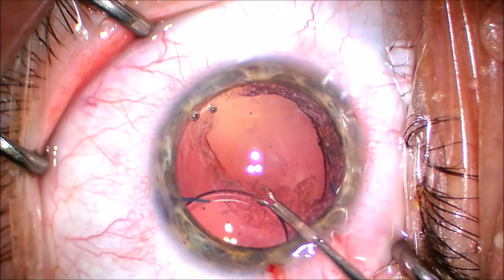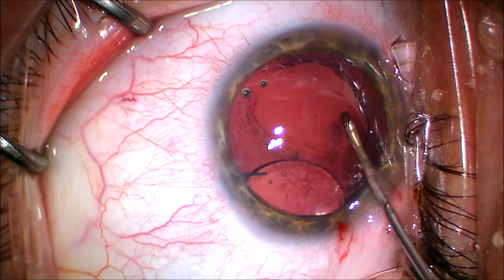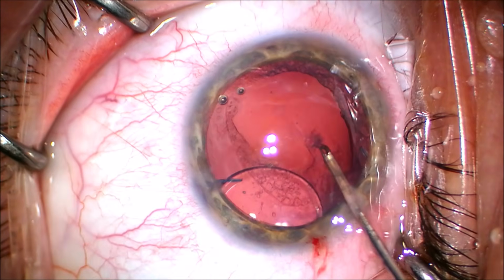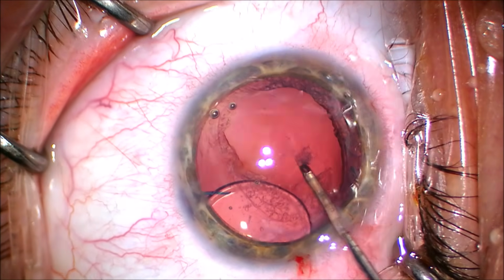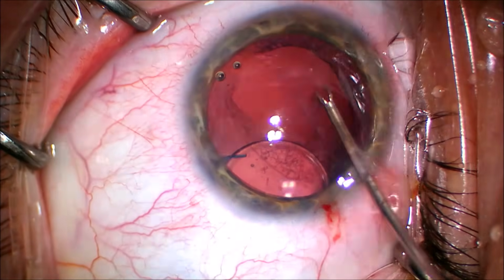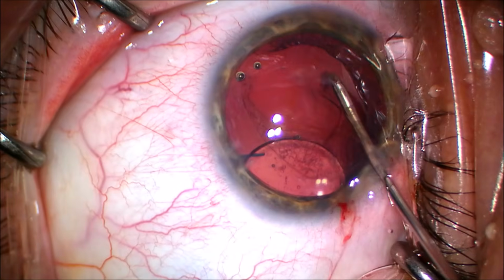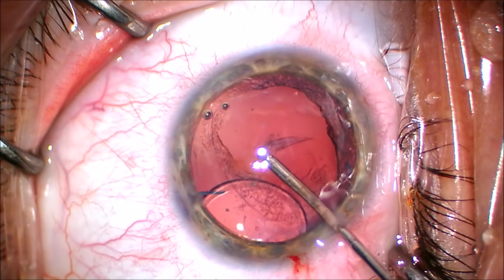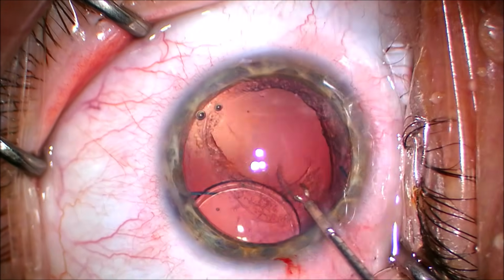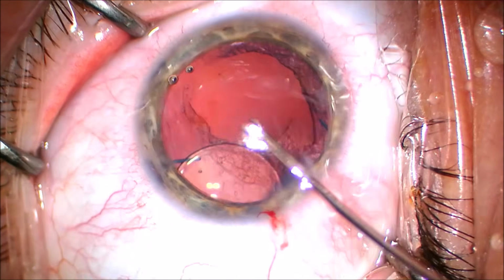I'm going around, turning the corner here. I have about half of the rhexis completed now. It's very important that you grab that edge of the rhexis flap appropriately here. Now you can see I went all the way around. Fortunately, it did not radialize out. And so this is the last bit of remnants that I have to just finish off the rhexis.